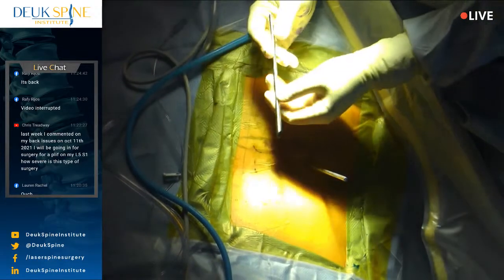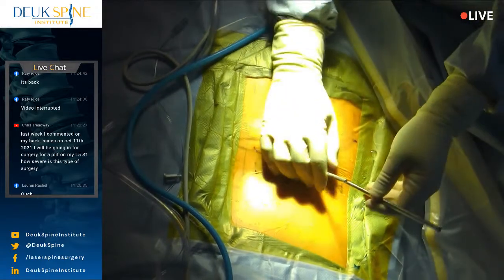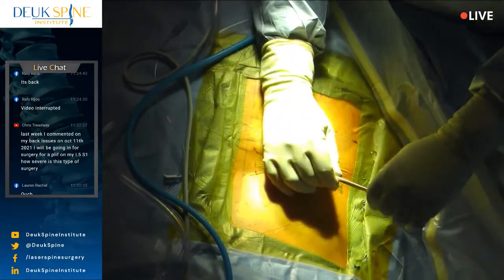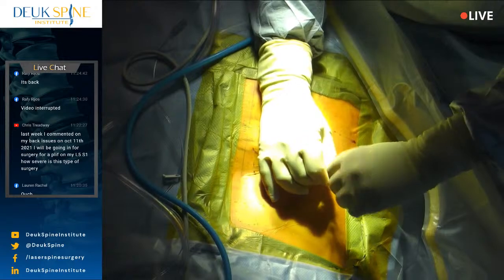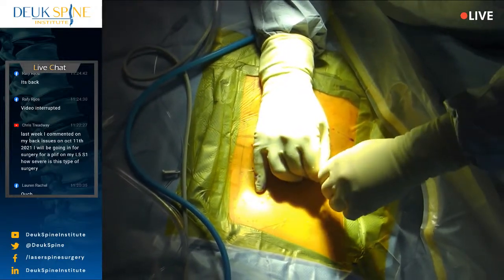That's about 2/3 right there. Now we're going to do the entire surgery through this endoscopic tube. It's called the tubular retractor. And the whole surgery will be done through the center of this thing. It's like a McDonald's shake straw, just made out of metal.